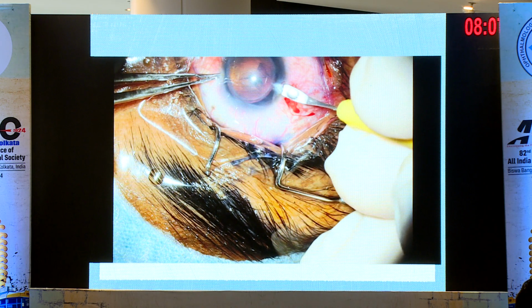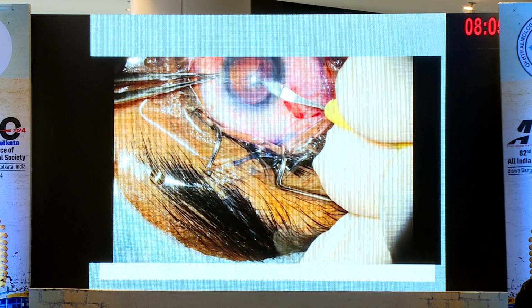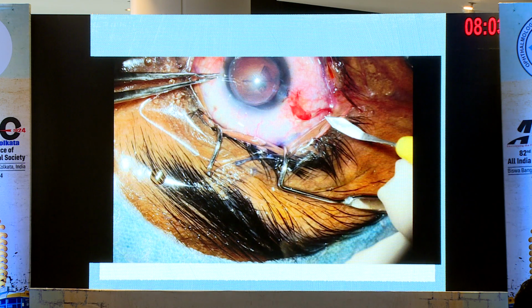When doing phacoemulsification after a DSEK, you have to keep some things in mind. One is your entry wound. If your graft is well centered, then it may make sense to do a scleral tunnel, and always try to enter outside your graft. If it is a decentered graft, choose the side where you have more working space so that your entry is away from the edge of the DSEK graft.